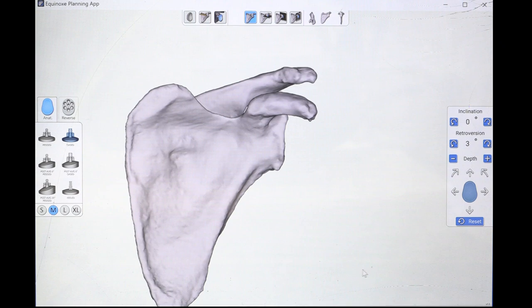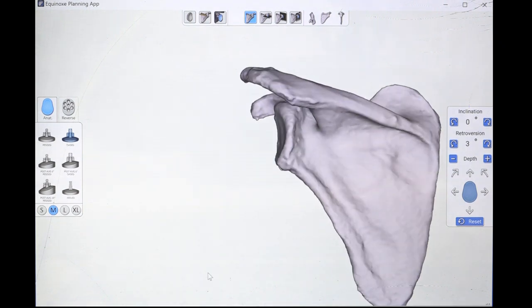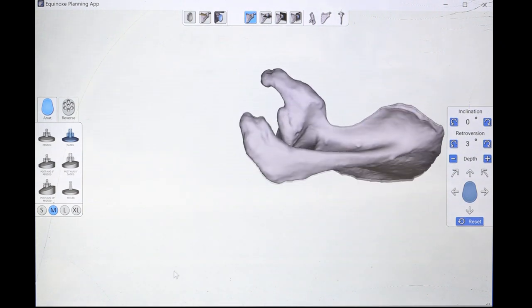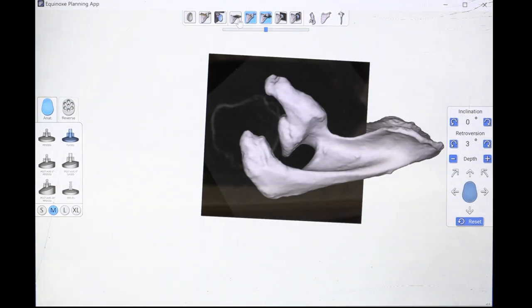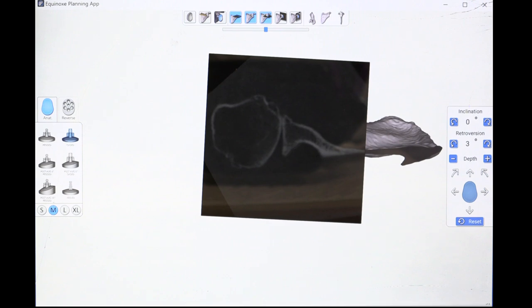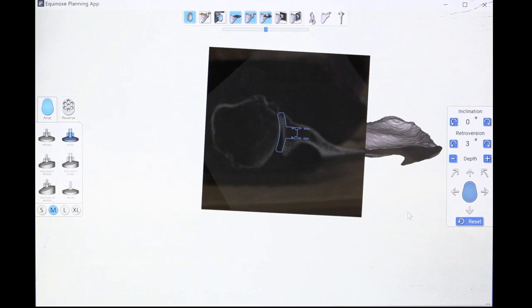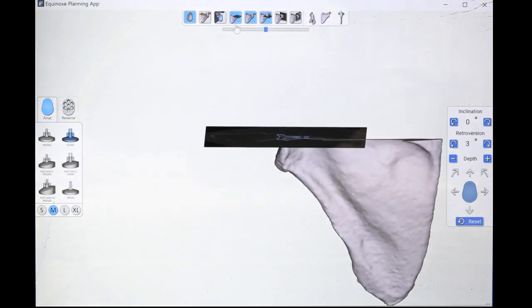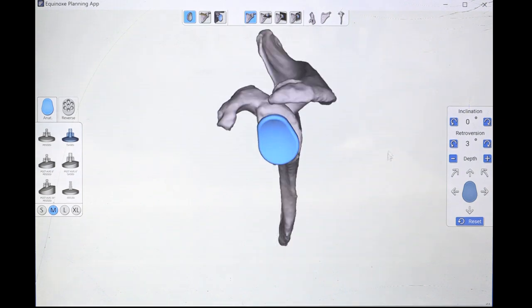Based upon a preliminary CT, a three-dimensional reconstruction of the glenoid is created, enabling the surgeon to evaluate the glenoid structure, specifically glenoid erosion and subsequent version, to appreciate the compatibility of the desired glenoid implant and the potential penetration of the glenoid cage pegs or cement through the glenoid vault cortex.